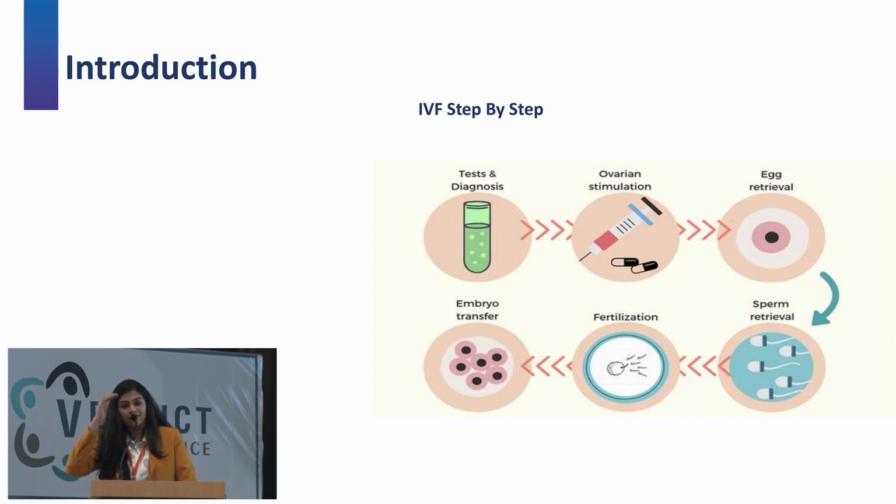On day -1, first we have to incubate the media based on the number of follicles that are expected. We keep a check on the disposables that will be used on the next day, and we see if something is missing, or probably just ready a whole list of disposables that will be used. Paperwork, of course, is prepared, consent forms, just an estimate. Suppose if there's a frozen embryo transfer, around 5852 is the cost.